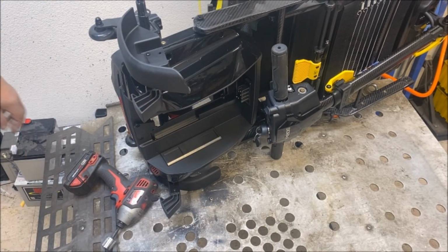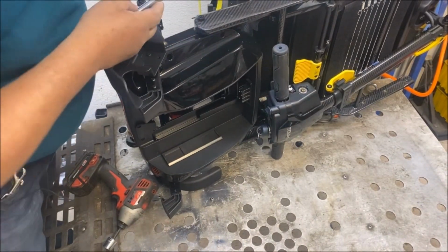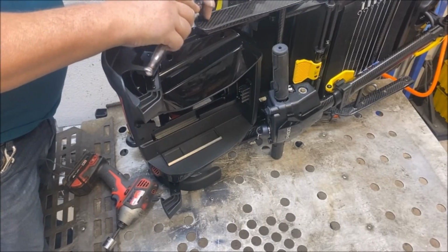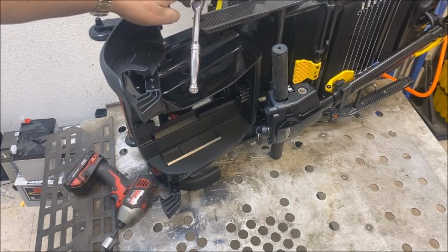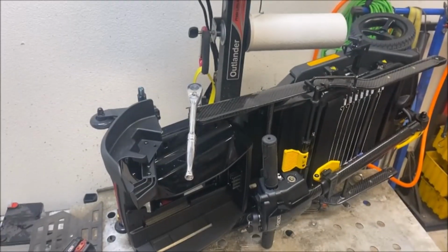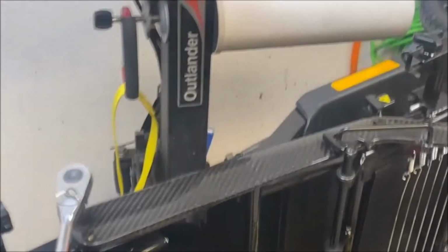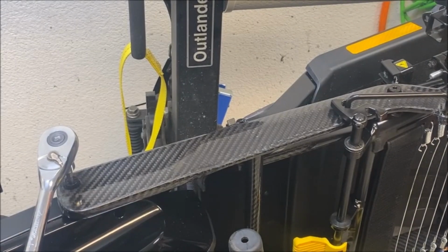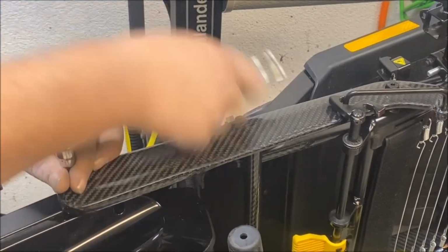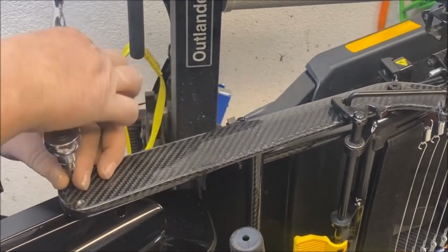So I can swing that out of the way. Now I can remove this bolt and this bolt. You can see that. So there's 2 bolts to release. There's a lower bolt and then an upper bolt up there. And that should release the seat frame back.